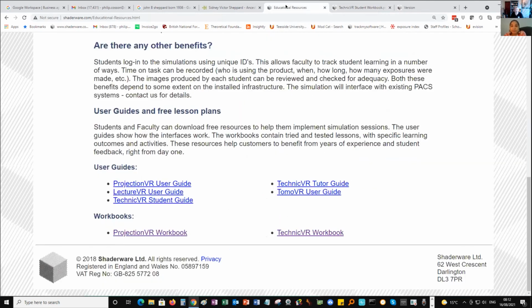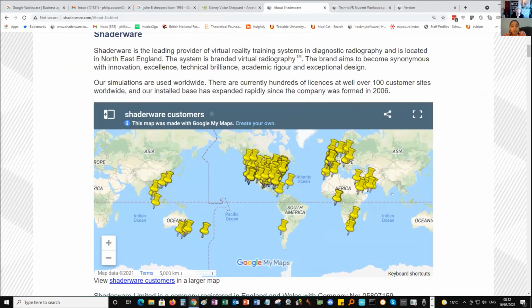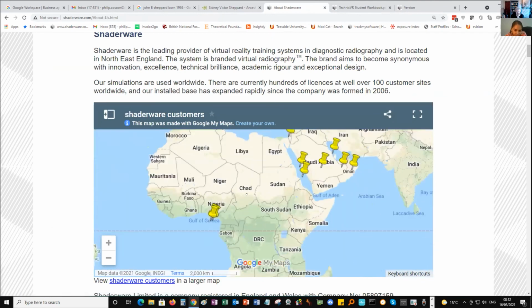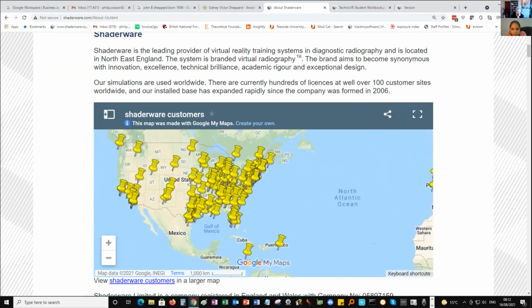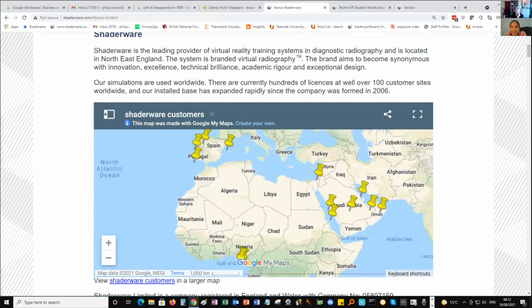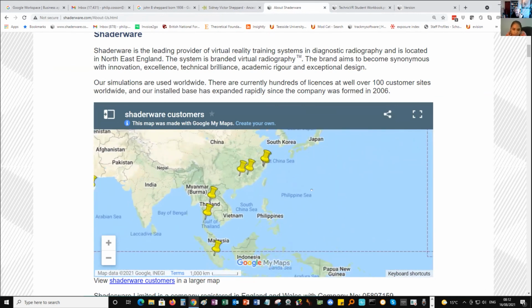Brilliant. In terms of where we are in the world, as you can see, it's very popular. Last year we had our most successful year ever because of the pandemic. Everybody was in the same boat thinking, how are we going to do virtual classes? But we've been selling this since 2006, so we've been developing it.